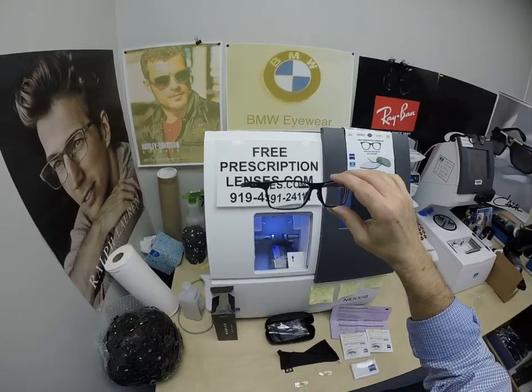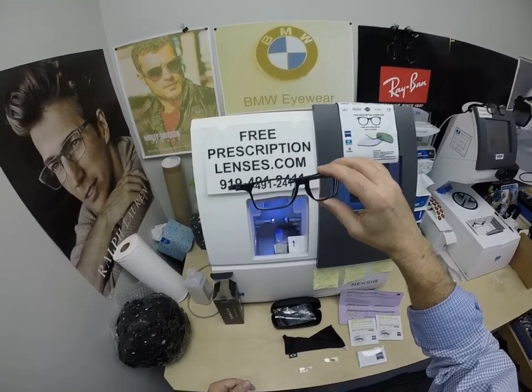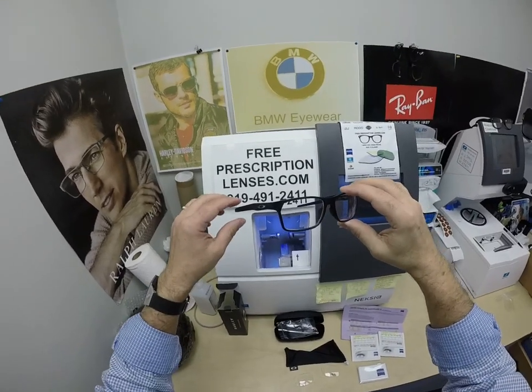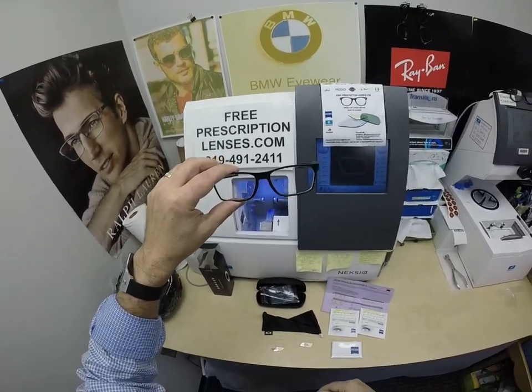This frame comes in four colors, two sizes — a 55 and a 57. Daniel is getting the 57. The frame sells for $152 and comes with one free pair of clear single vision prescription lenses.